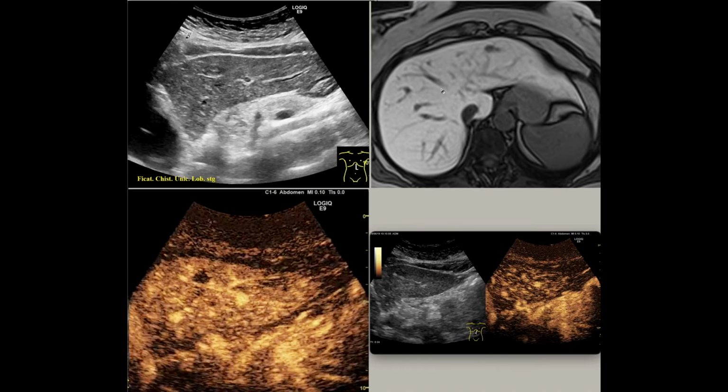In a relatively overweight patient, subcutaneous cellular tissue and preperitoneal fat can be seen, which is abundantly represented given a thin abdominal wall, probably in a relatively sedentary patient. It is important to picture the liver, which has a homogeneous structure and a normal appearance.